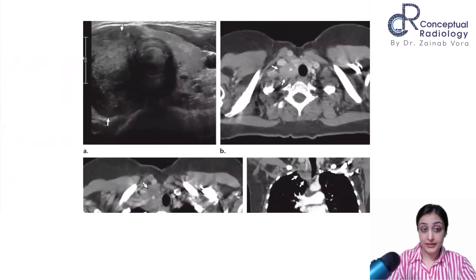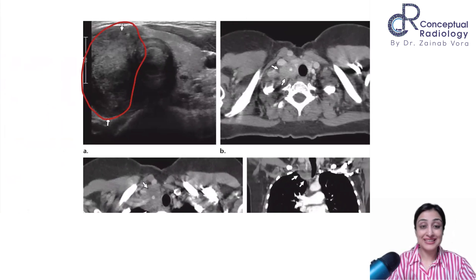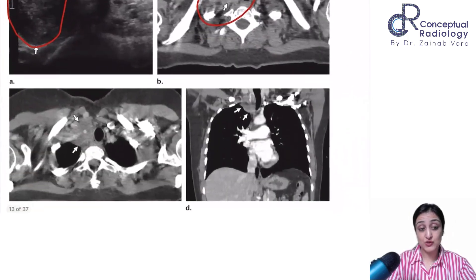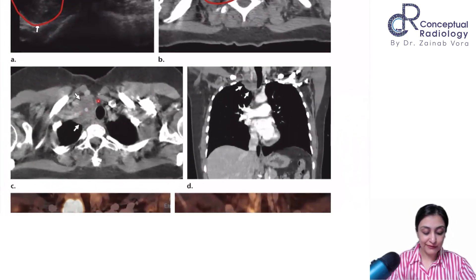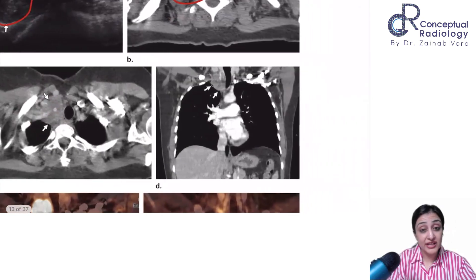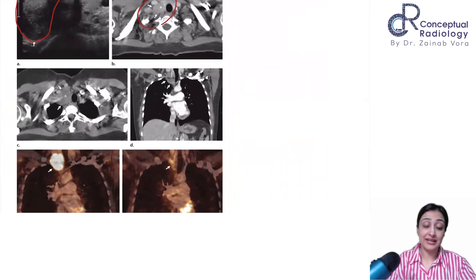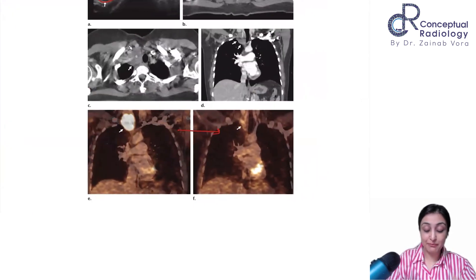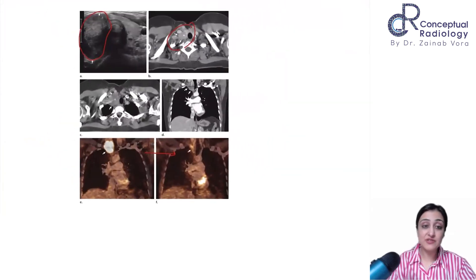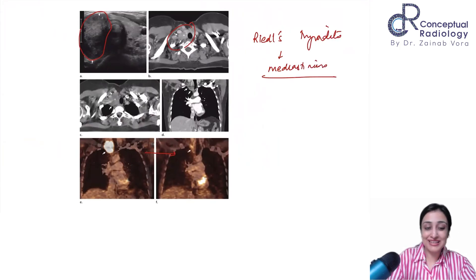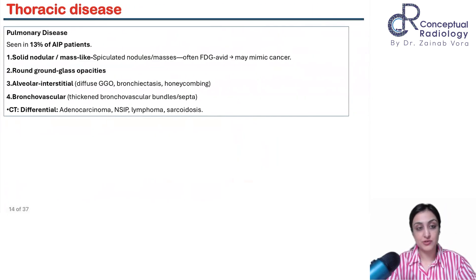Another case: clinically a stony hard swelling. Ultrasound shows infiltrative hypoechoic thickening. CT shows very infiltrative tissue encasing the carotid artery — this is Riedel's thyroiditis encasing the brachiocephalic and common carotid vessels and extending into the mediastinum. PET shows uptake, mimicking cancer. Upon treatment, there is marked reduction in mass size — it just disappears with steroids. That is the hallmark.